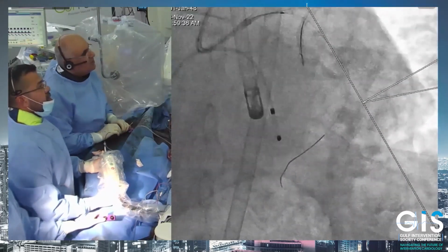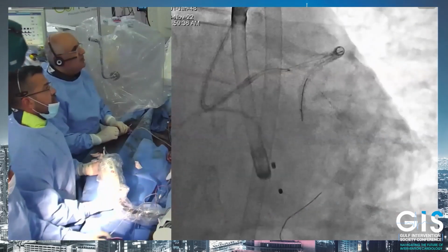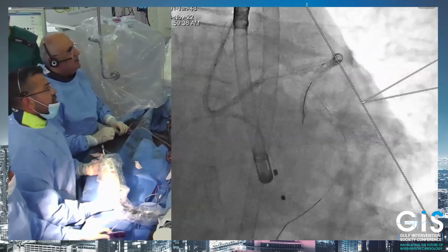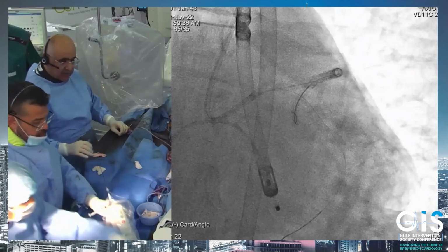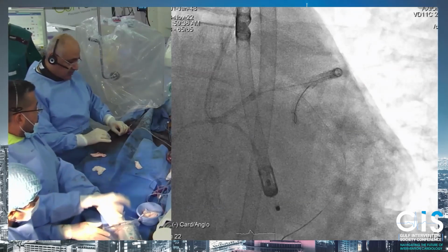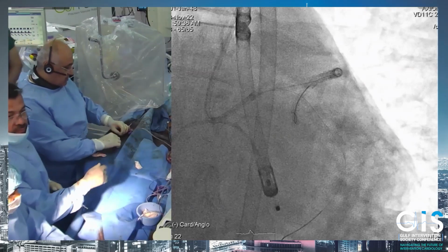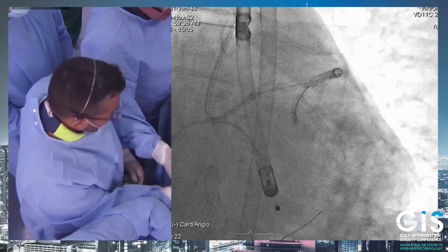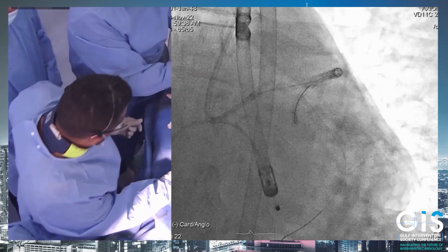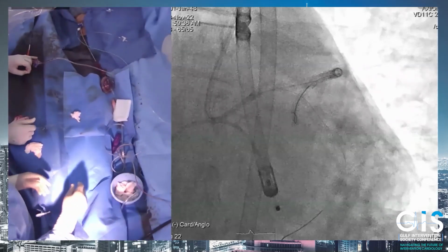Can I have PA caudal, please? So this is the OCT catheter. As you see, I did have some problem crossing even after that 1.5. It's not possible to cross with the OCT. So what I could do, I have, for the educational sake, actually an IVUS ready also, with probably better support. I'll try. I'm not guaranteeing to see with the IVUS, but I will see if I can do imaging before. If not, I'll have to go with a 2 balloon and do more dilatation.